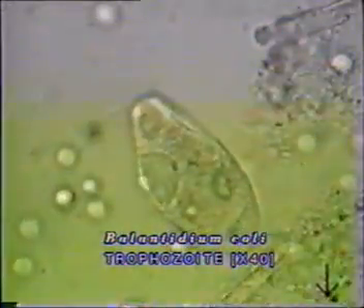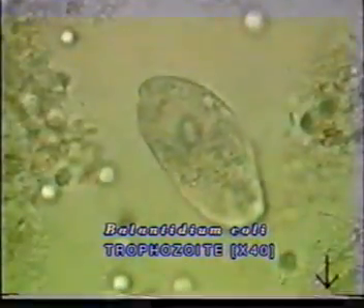This is the Giardia trophozoite showing its characteristic falling-leaf motion. What you see here is Balantidium coli, the largest protozoan parasite of man. It is around 50 micrometers and is covered with cilia. Note the morphology of the parasite with a prominent cytostome and the movement of the cilia. It moves rapidly and often turns in circles.